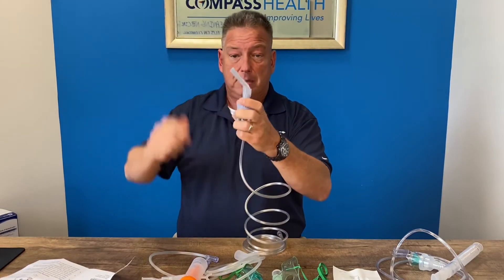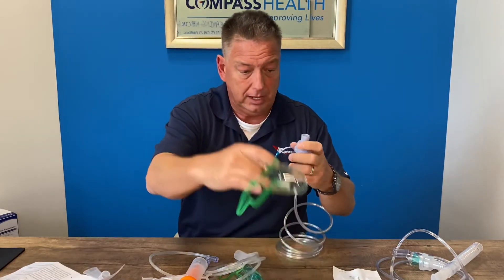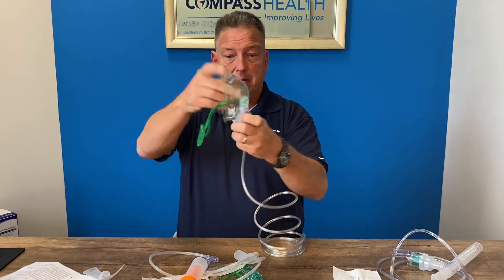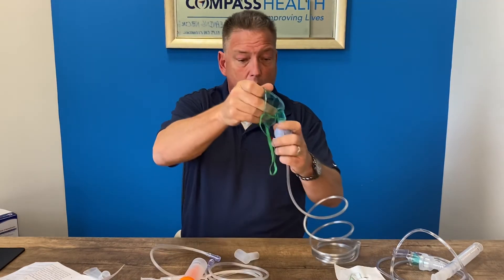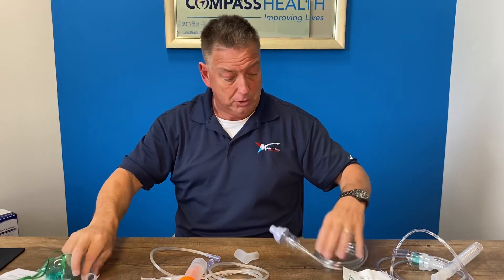It comes with a top-load mouthpiece and will take either an adult or a pediatric mask. All these components are available separately, and depending on the prepackaged units, these accessories are available with many of our Roscoe Medical nebulizer compressors. Thank you very much for joining me today.